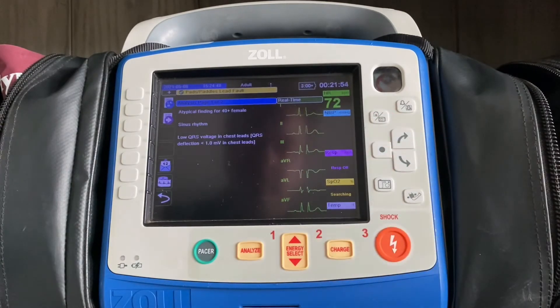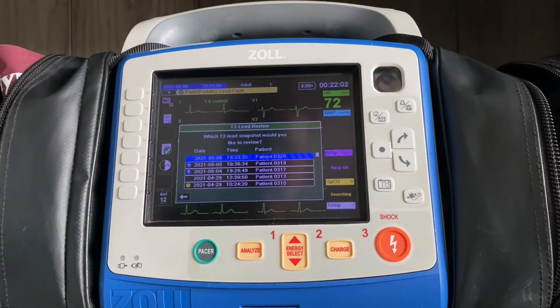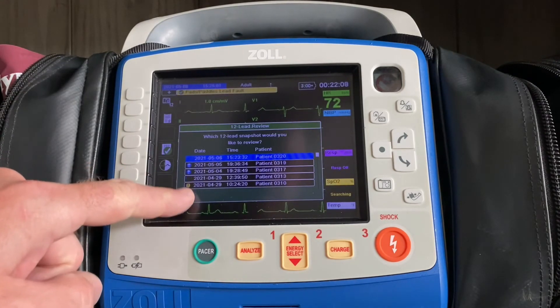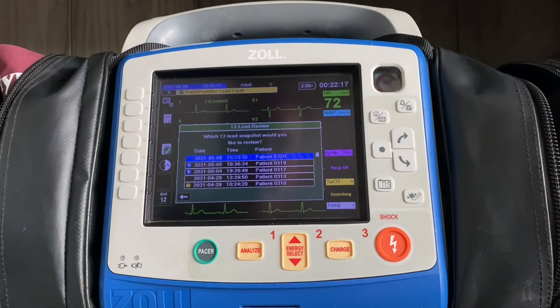If for some reason the hospital does not receive the 12-lead, on the second page of options there's a green check mark. You can go in and see whether or not those 12-leads were sent successfully. The ones with the yellow circle and exclamation point means you tried to transmit and it did not go through successfully. The blue circle with the white arrow pointing up means it transmitted and went through successfully.